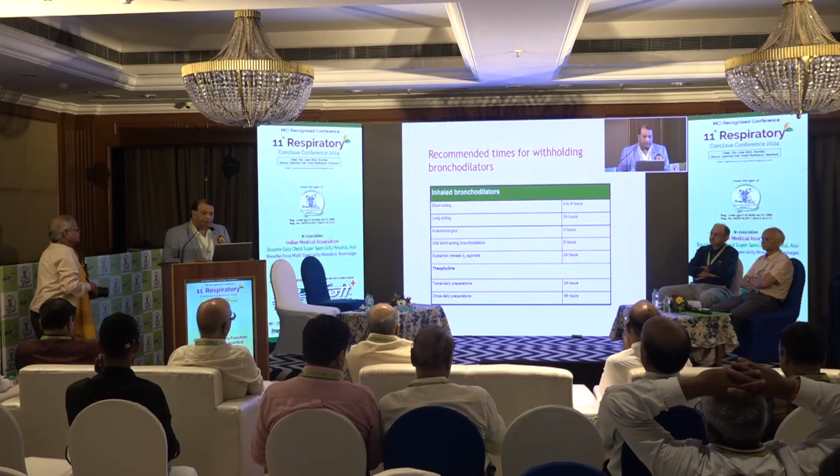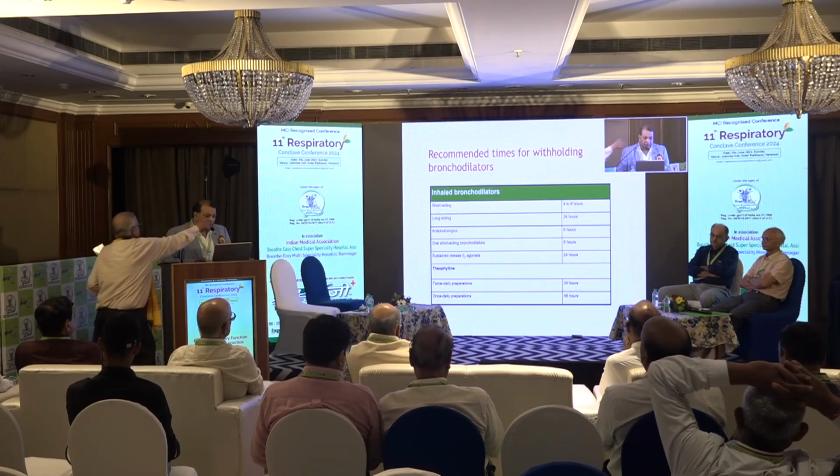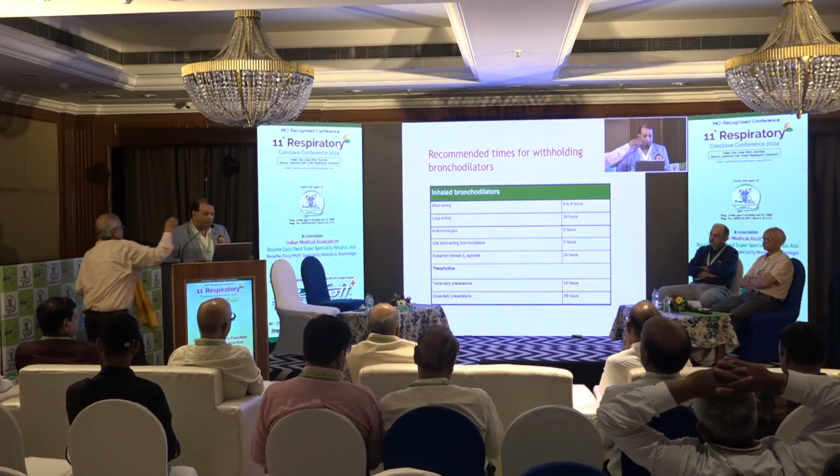Inhaled bronchodilators are generally recommended to be withheld: short acting 4 to 8 hours, long acting 24 hours, anticholinergics 6 hours, and oral short acting bronchodilators 6 to 8 hours, sustained release beta 2 agonist 24 hours, theophylline once-a-day preparation 48 hours.